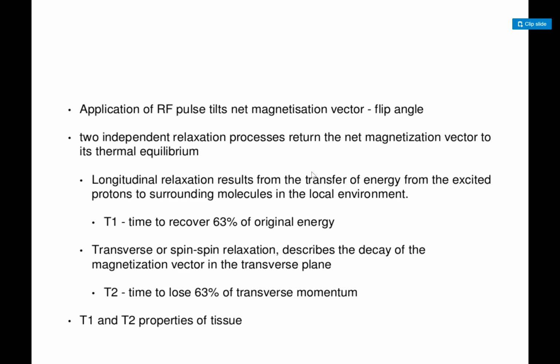And when the transverse relaxation happens, T1 is back to the z-axis. I got it opposite. The transverse happens in the XY plane. We call it spin-spin relaxation, or sometimes the decay of the magnetization vector, and it's called T2. Okay, so in the XY plane, it happens way earlier. So T2 is usually smaller than T1. T1s are in the thousands for myocardium. T2 will be around 50, so almost 25 times less.